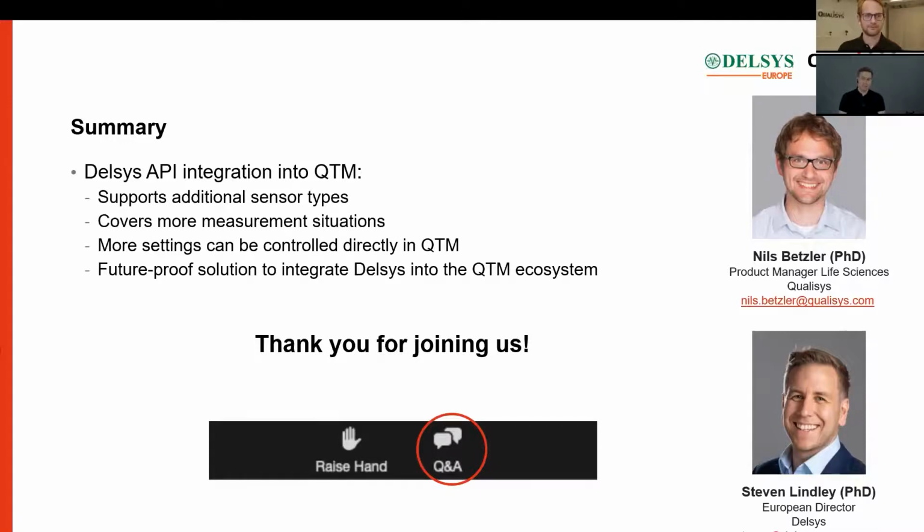No is the simple answer. This is one of the advantages of the API integration. What Qualisys have been able to do is take some of our core DLL files and integrate them into QTM and the installation of QTM, which means the handling of the Trigno system is all happening through QTM. There isn't a requirement to use the Trigno control utility.